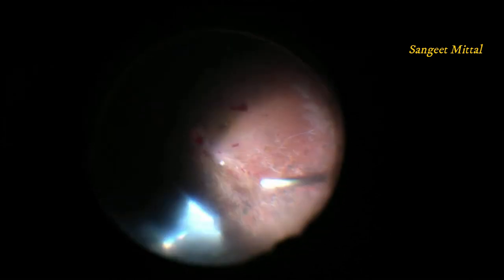A thorough vitrectomy was completed. Peripheral pre-retinal hemorrhage was seen. Again, a layer of vitreous was separated from the retina by peeling the vitreous from anterior to posterior direction.